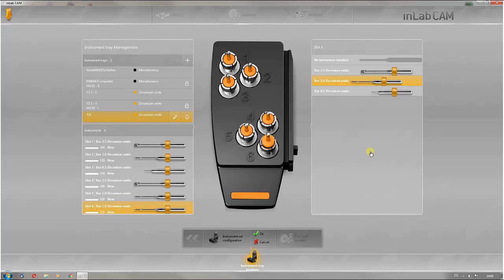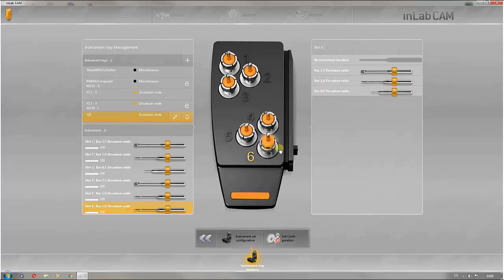Clicking on OK saves the instrument tray. This tray can then be used for all available machines.